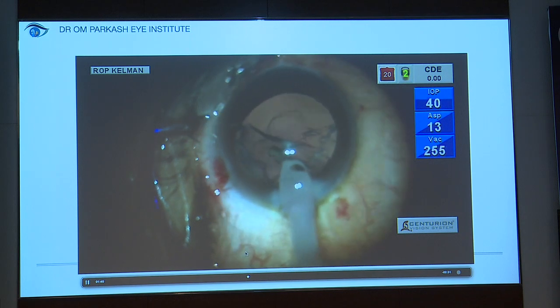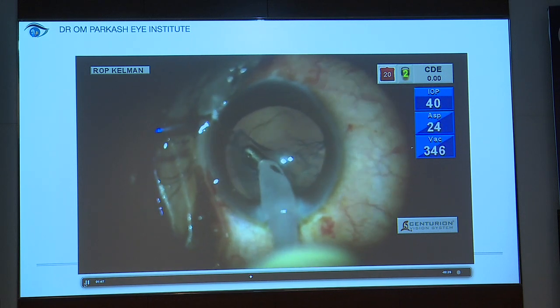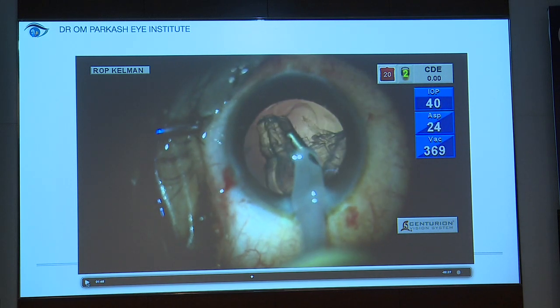What I'm doing now is, the ideal situation when you have an open posterior capsule is that you should do a bimanual one. Why is a bimanual one done? Because we want a different plane of irrigation and a different plane of aspiration. Here, the trick which I have done is, I have retracted the sleeve. This retraction of the sleeve is a compromise, no doubt. Having a bimanual is a much better one.